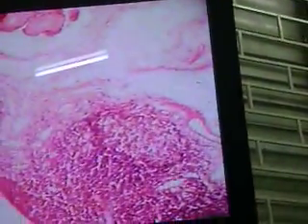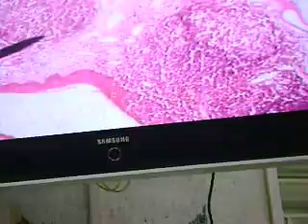So let me go through those points. Sorry, I just disturbed you. One, the epithelium, stratified squamous. Two, lymphoid tissue. Three, skeletal muscle. Four, glandular tissue. And five, a hemicapsule. Okay? So five distinguishing features.